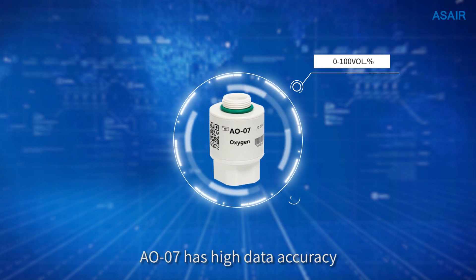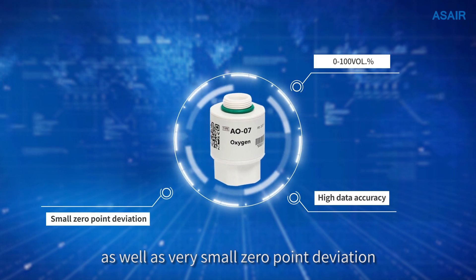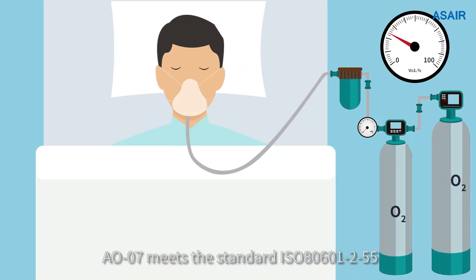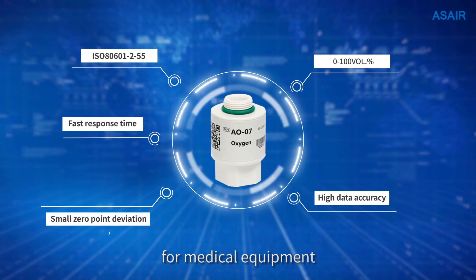AO07 has high data accuracy as well as very small zero-point deviation. It can respond quickly to changes in oxygen. AO07 meets standard ISO 80601255 for medical equipment.